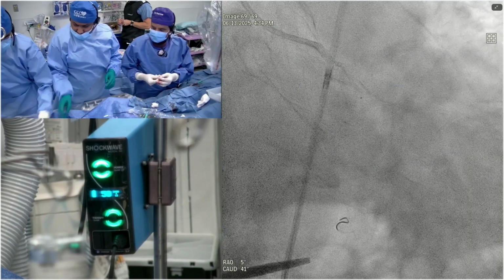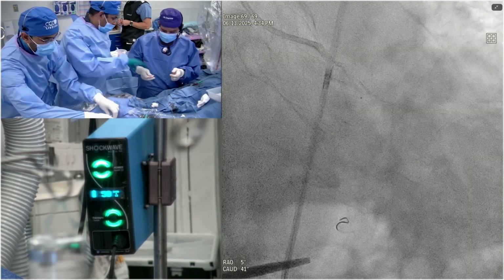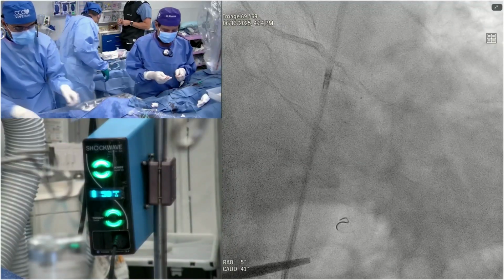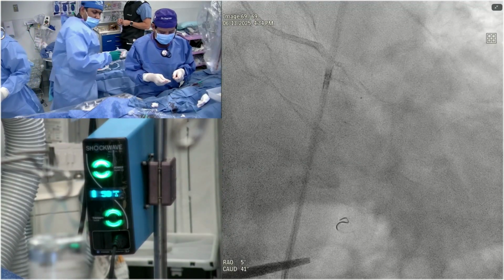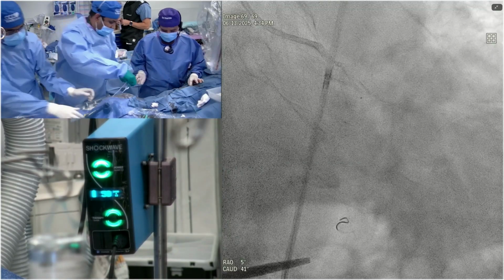Andrew, can you hear me? I'm not sure this was aligned properly. We hear you here. Can we show Kenny the animation? I'm not sure that was aligned from the tower catheter, if you can. We have it here. We're showing it right now.